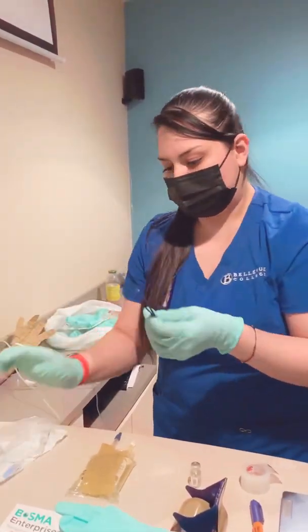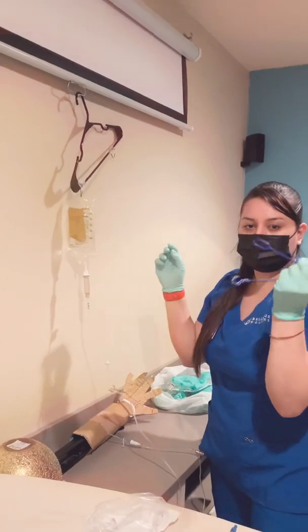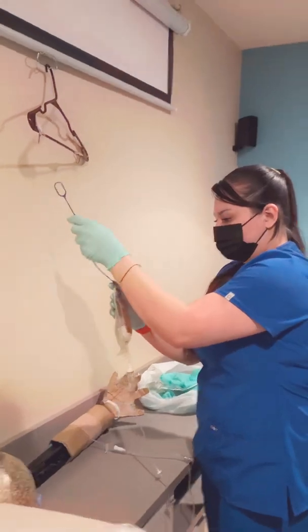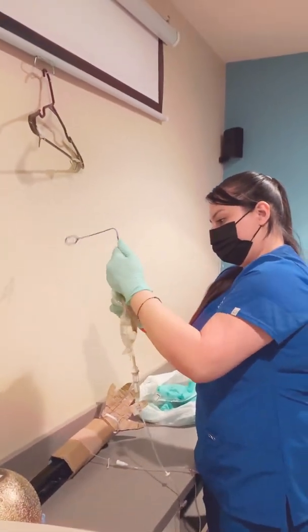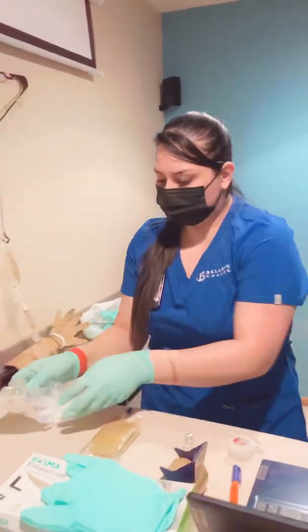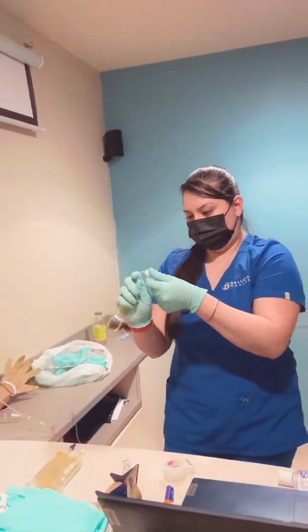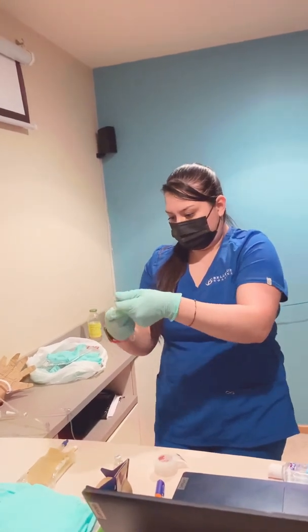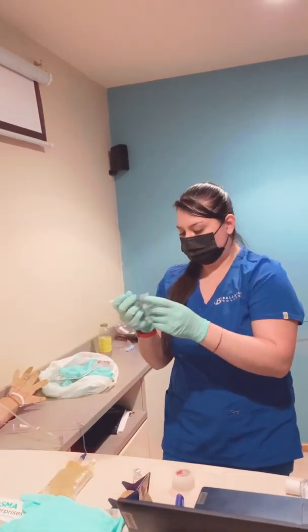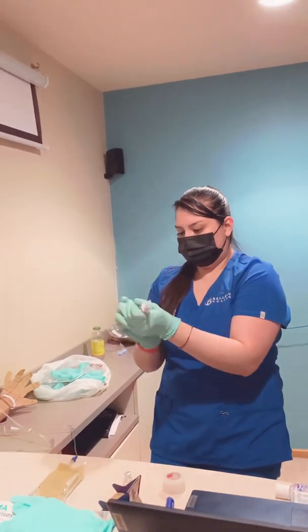I'm going to first take out my hook, and I'm going to lower my bag hanger, this is a hanger. I'm going to grab my hanger, and I'm going to lower my primary bag. Just like that. And then I'm going to open the rest of my packaging, making sure I clamp. And then I'm going to label my tubing with the date, time, and initials.